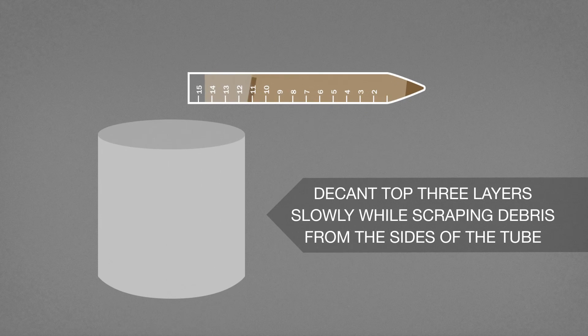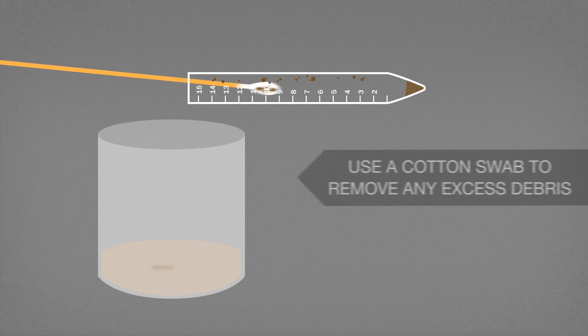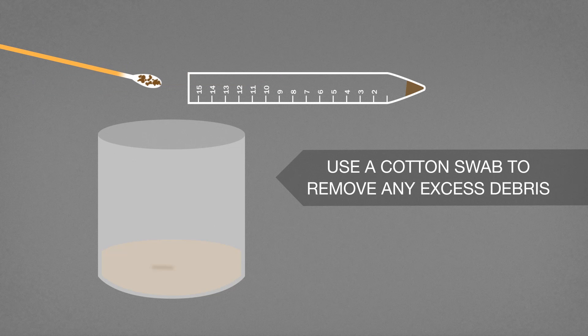Decant the top three layers slowly into an appropriate waste container while scraping debris from the sides of the tube with an applicator stick. Use a cotton swab to remove any excess debris.